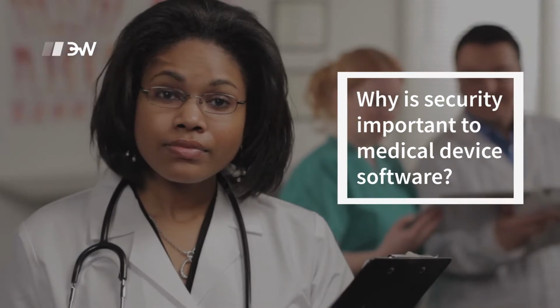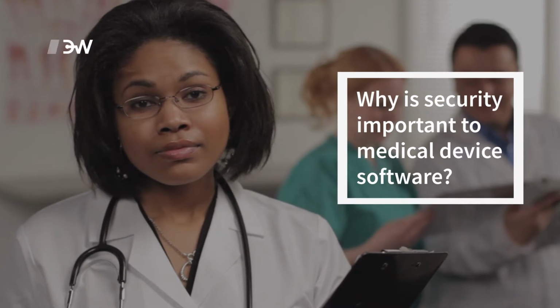Why is security important to medical device software? In the medical setting, I think it brings a lot of urgency to the classic security properties of confidentiality, integrity, and availability. Confidentiality, because you're potentially dealing with sensitive patient medical data. Integrity, which is some of the stuff that you touched on, Dan.